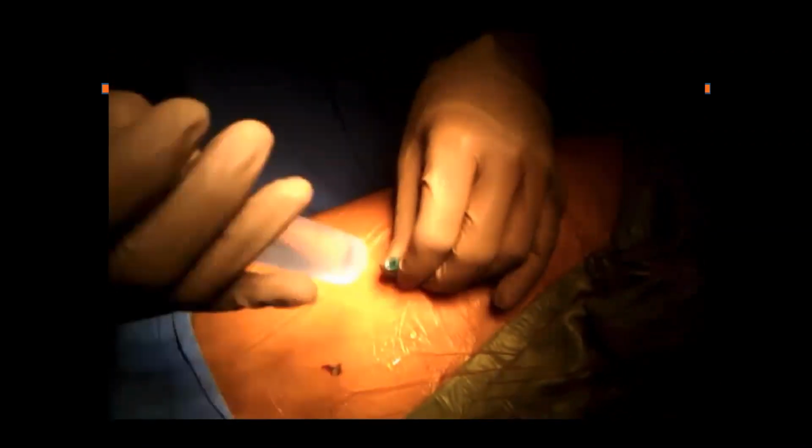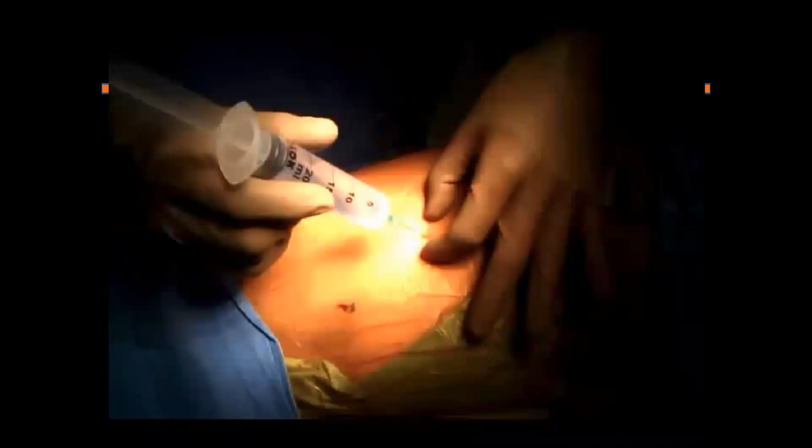What is the problem with that? Not going into the blood vessel. Should not inject lignocaine into the blood vessels. What will happen? Arrest. What will happen? Arrhythmias. Hypotension. Directly arrhythmias, not hypotension. Hypotension may happen as a result of arrhythmias. So you should not do it because there will be arrhythmias.